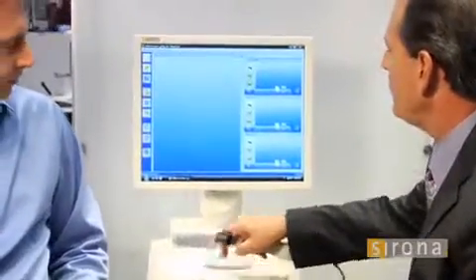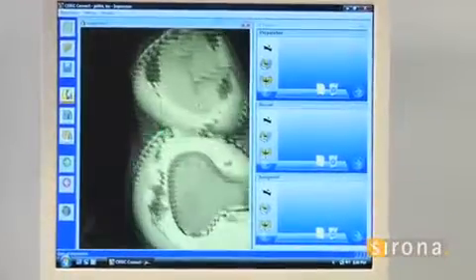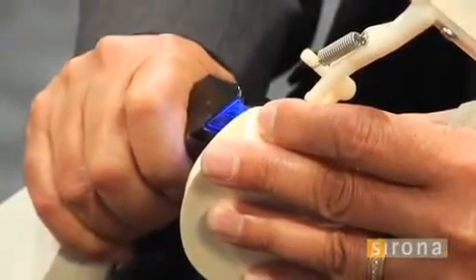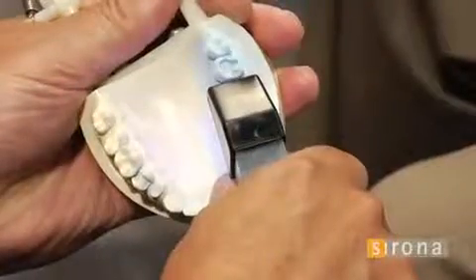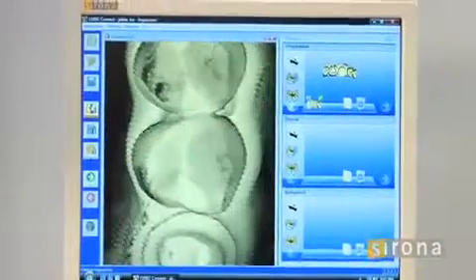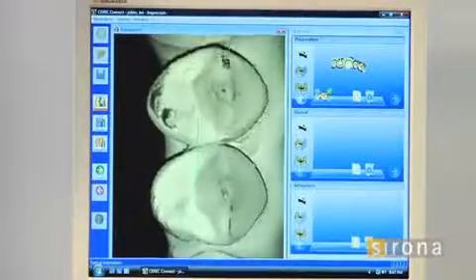Let's take a look — we'll do a half arch here for time's sake with the blue cam. There are different settings on here for tolerances to taking the scans, and it's constantly taking pictures. When you hold still, that's when the pictures line up and it stitches things together. I'm always looking at the screen, not in the mouth. After 10 years I have a feel for what's going on, and when I get to the bicuspid area and get that stitch, I roll to the buccal.